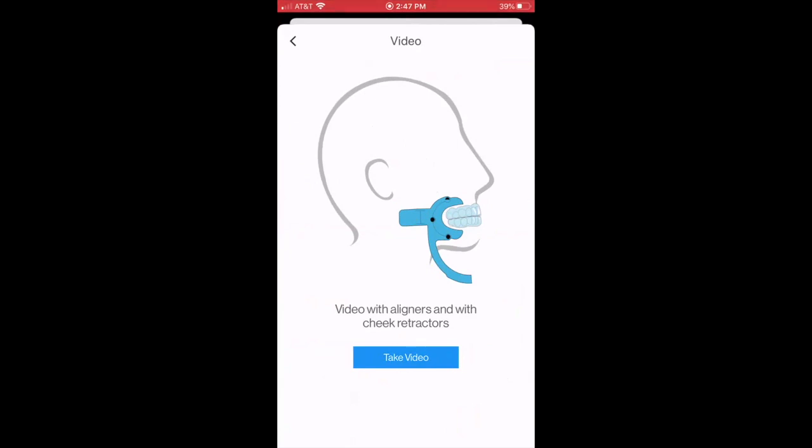There's a bunch of different ones. This is good because you don't have to hold it with both hands. You can kind of just stick it in your mouth, and then you can take your video. I think they made these for that board game that was out a while ago. I know what you're talking about.